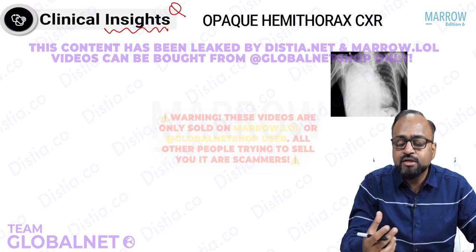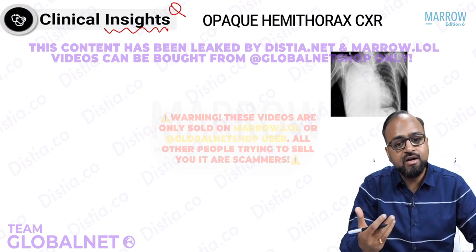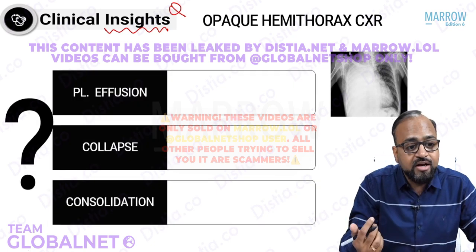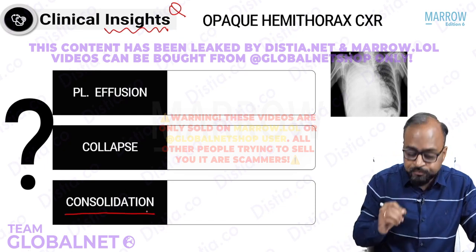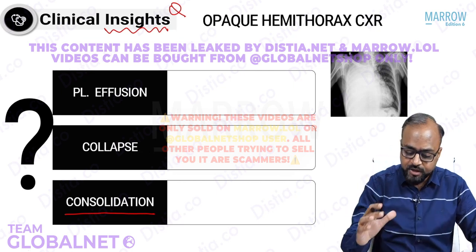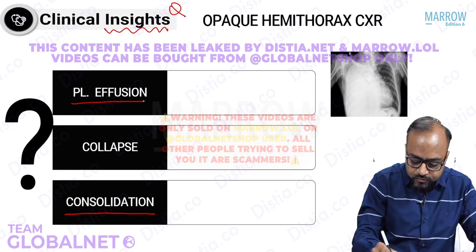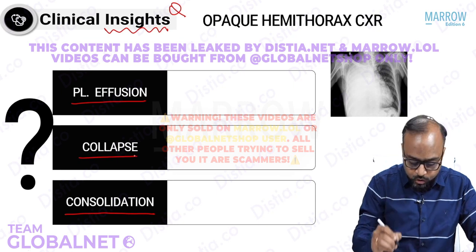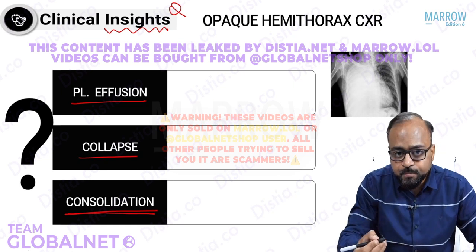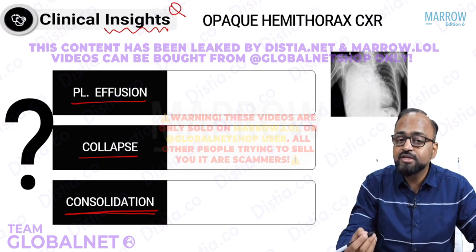Now we have just seen that it could be massive pleural effusion which could give rise to opaque hemithorax. What if an entire lung is collapsed? It will appear white, so that will also give rise to opaque hemithorax. What if an entire lung is consolidated? So that will also give rise to opaque hemithorax, isn't it? So the basic differentials of opaque hemithorax could be that the underlying predominant abnormality is either a pleural effusion, or complete lung collapse, or massive lung consolidation. Now, is it possible for us on a radiograph to try and predict what the predominant underlying abnormality could be? Indeed, it is possible to do that.